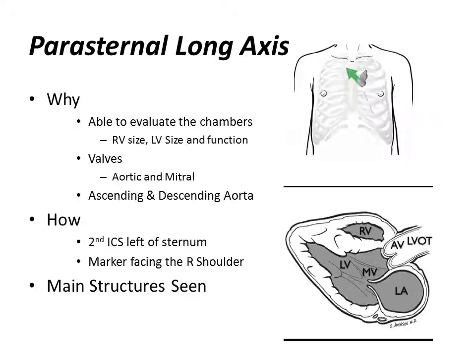Hello, in this presentation we're going to quickly talk about some of the standard echocardiographic windows, sort of 2 out of 3 major echocardiographic windows. Very quickly, you would get hopefully a lot of practice with those when you come for the course, and there would be an introductory lecture at that time.